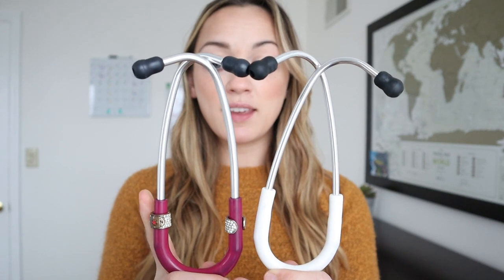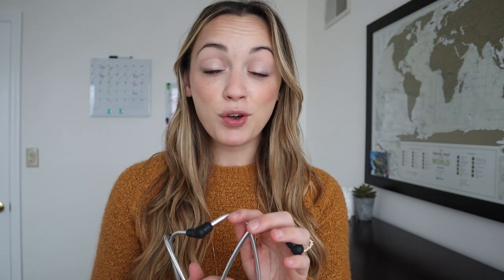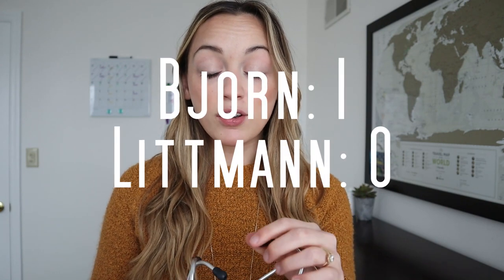When looking at the top of these stethoscopes, it might be a little hard to see, but the metal ears on the Littmann Classic 3 are a bit thicker than the metal ear pieces on the Bjorn Hall stethoscope. Now let's go up to the ear piece that actually sits in your ear. A big point I will give to the Bjorn Hall is that it has multiple ear pieces over the Littmann Classic 3, and they're also a bit bigger, so they sit in your ear much nicer.